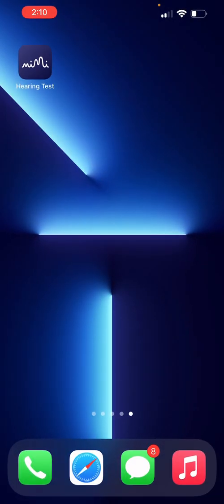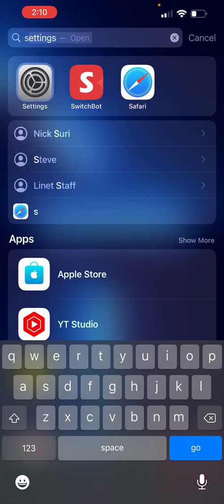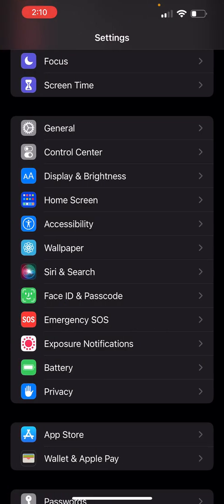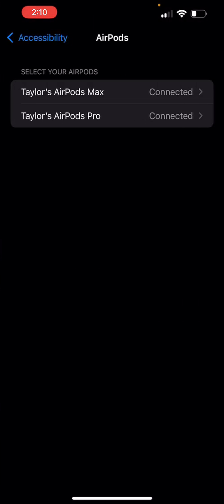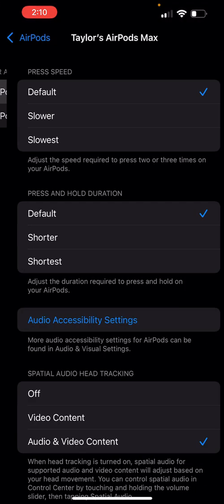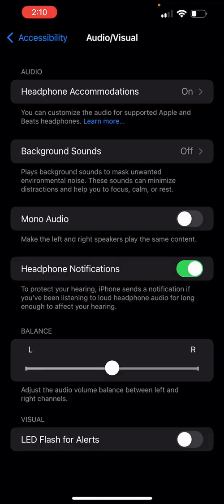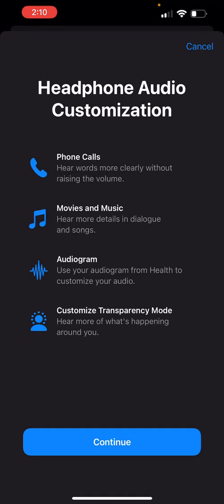Once the file is exported, you go into Settings, Accessibility, AirPods, in this case using AirPods Max, Audio Accessibility Settings, Headphone Accommodations, Custom Audio Setup.